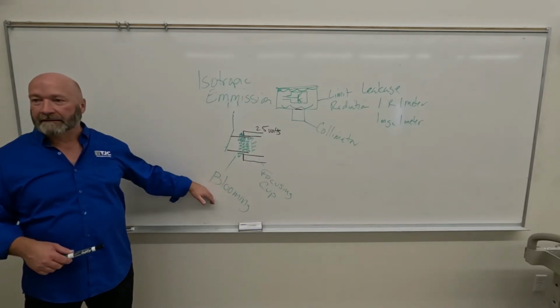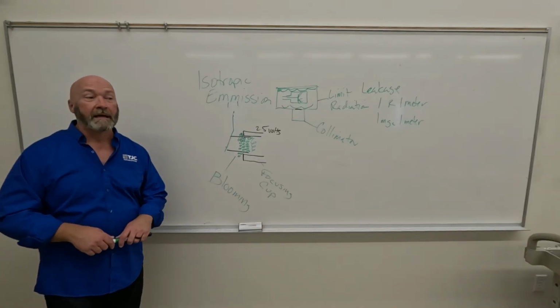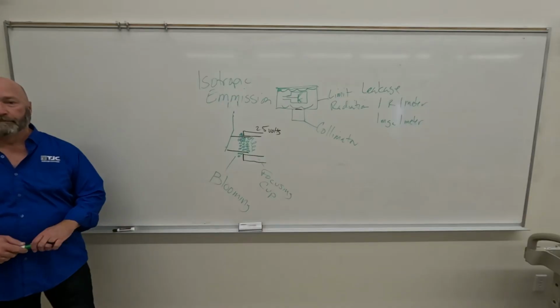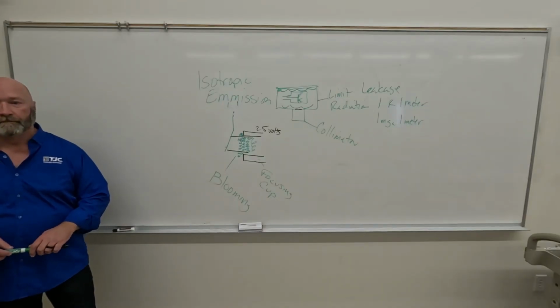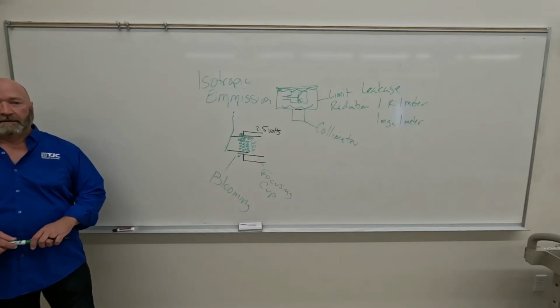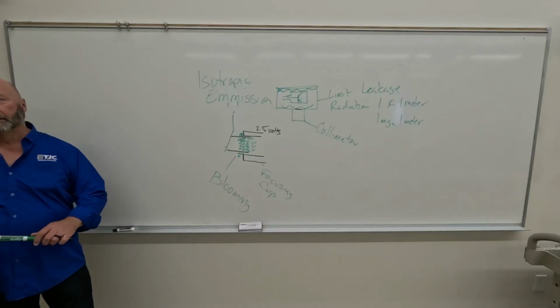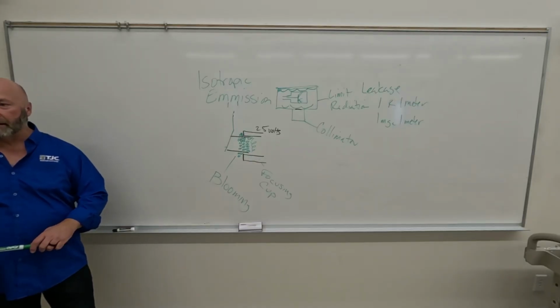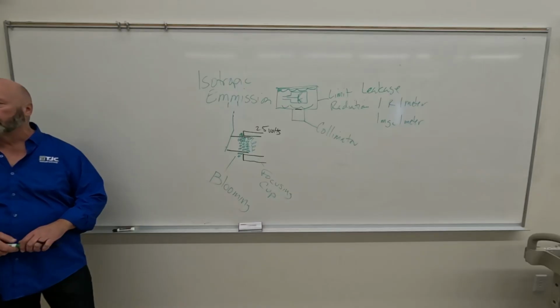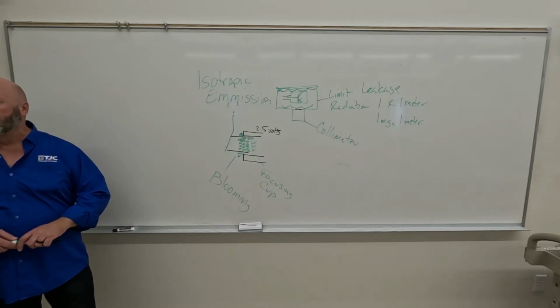You're driving heat. What's the main thing that kills an X-ray tube? Heat. Short exposure times. Is there a time to stand on a rotor button for a long time? Relatively long time? You're trying to do a child and trying to get that. Bingo. Yeah. With kids, yeah. Because how do kids, you got a screaming child. When do you want to make the exposure? In a split second that they go, eh, right?